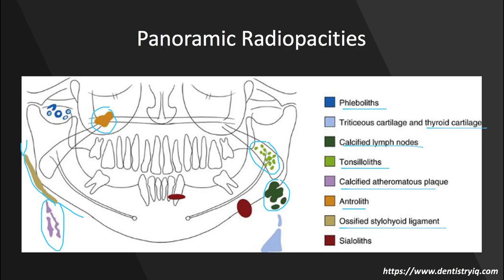And lastly, we can have sialoliths. These are often in the submandibular gland, which will be down here, or in Wharton's duct up by the mandibular incisors. It'll be a bit more flat if it's in a duct and more round if it's located in a gland. So just by looking at the location and shape, you can get a pretty good idea of what you're looking at.